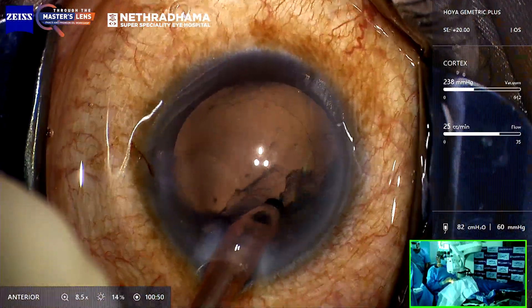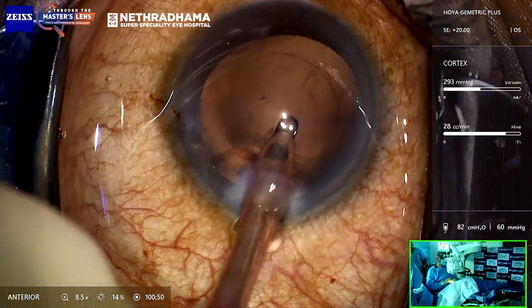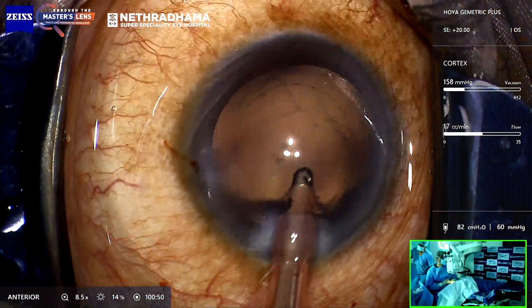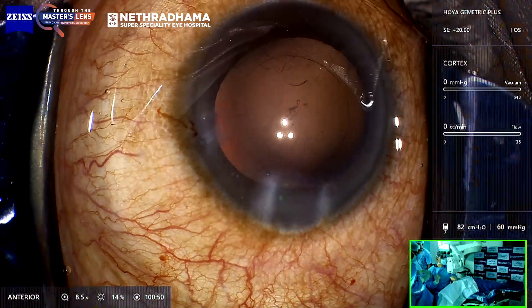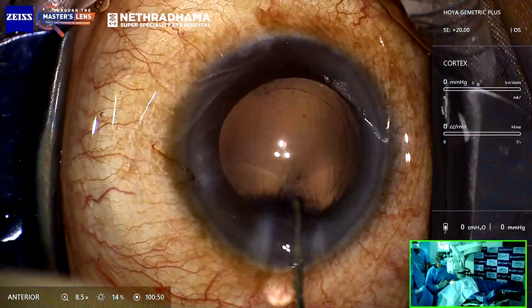That's the sub-incisional cortex. Most people have difficulty removing the sub-incisional cortex, but if your flow rate is high enough then the followability is good and you can remove it. You can see there is still some viscoelastic there. I like to do a little bit of hydro-polish to clean the posterior capsule.